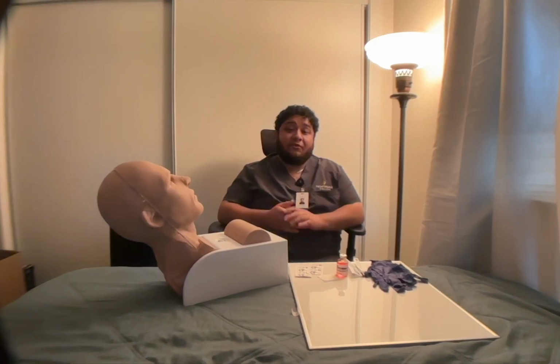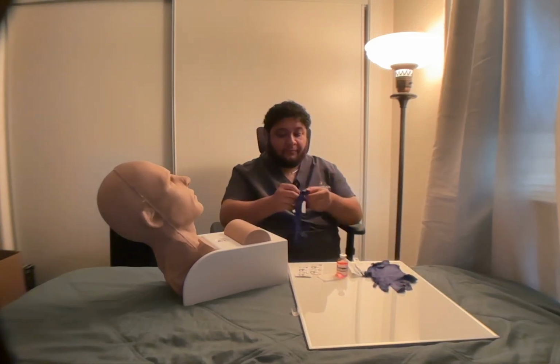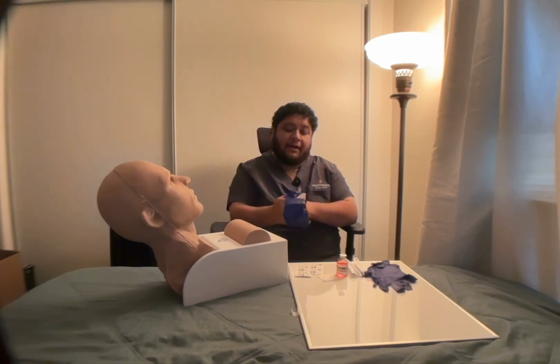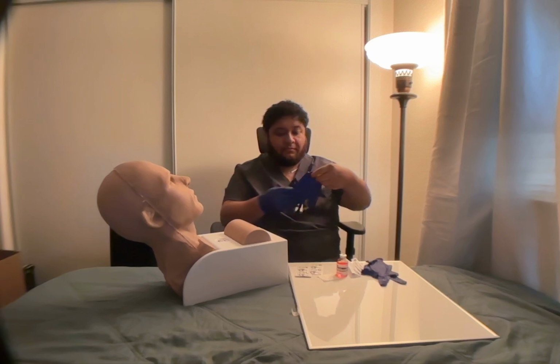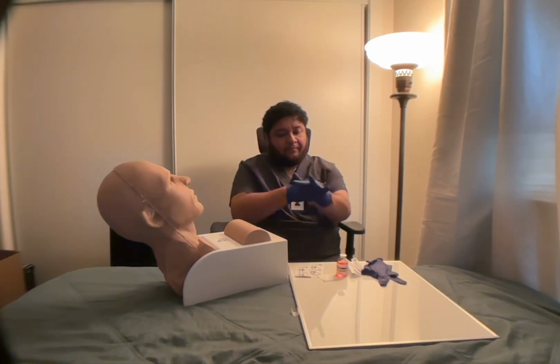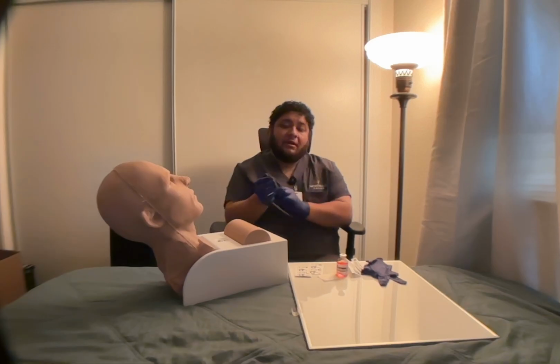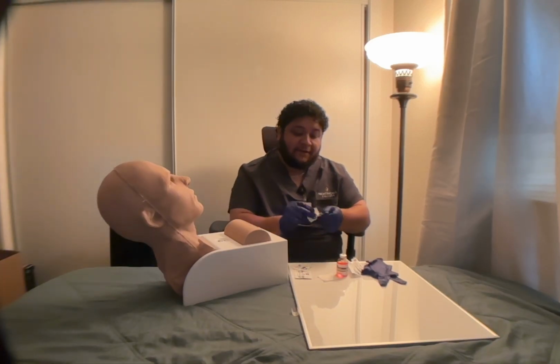Okay, I'm gonna go ahead and perform hand hygiene. Apply clean gloves, like so. Okay, now I'm gonna take an alcohol swab and clean the top of the medication vial.